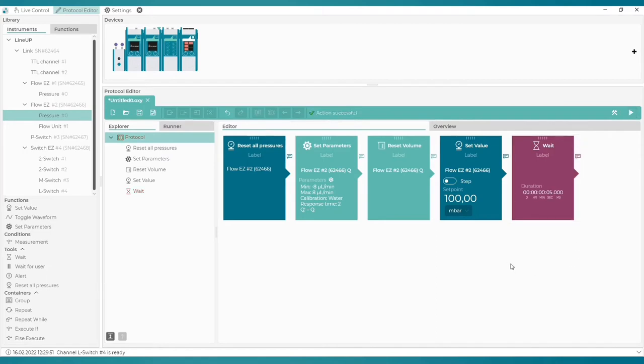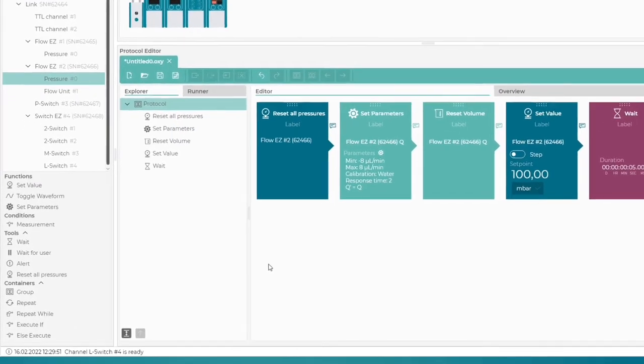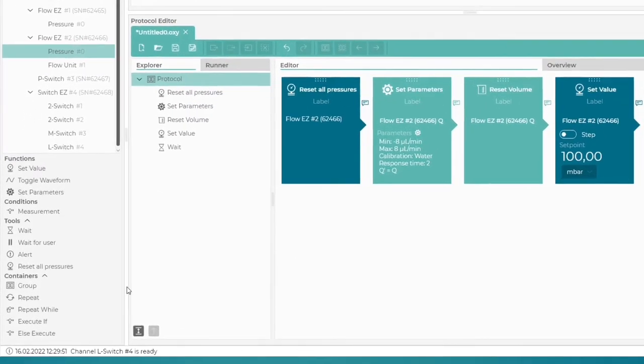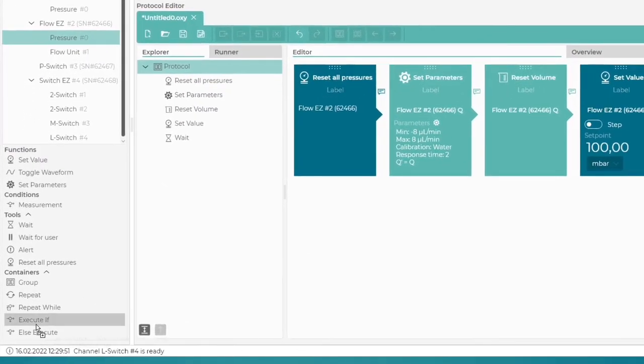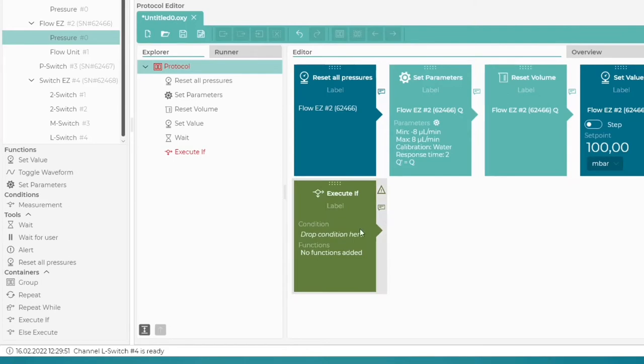Now after the system has been running for five seconds, we will check our conditions. Let's introduce the first one using execute if. Once the block is added to the protocol, we can see that it consists of one condition and multiple functions. These will be executed only if the defined condition is true.